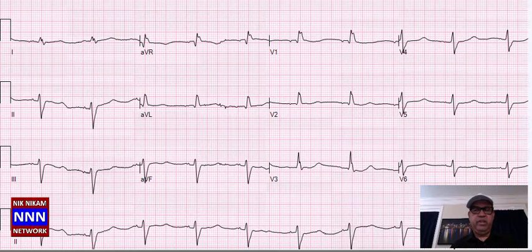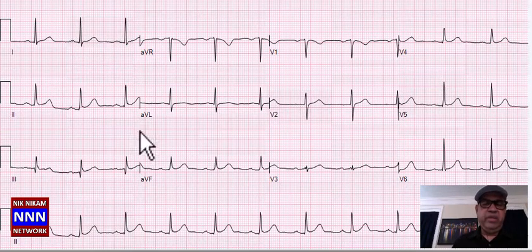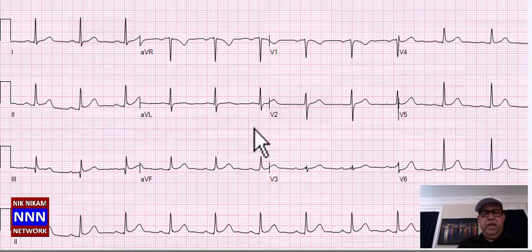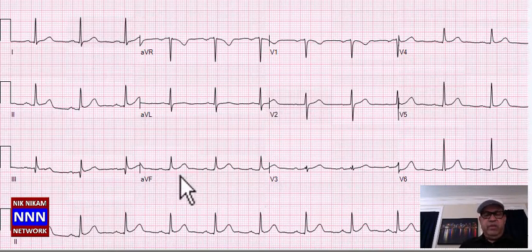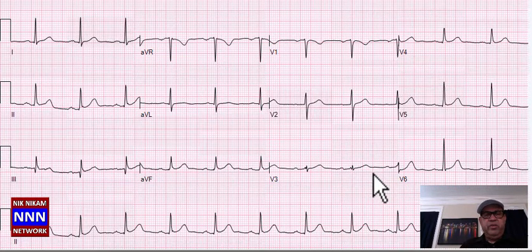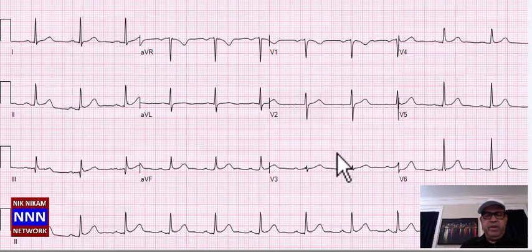Again we have sinus rhythm with nothing really significant except for mild ST elevation which could be early repolarization. The computer says anterior infarction but I don't agree with that — otherwise it's okay.